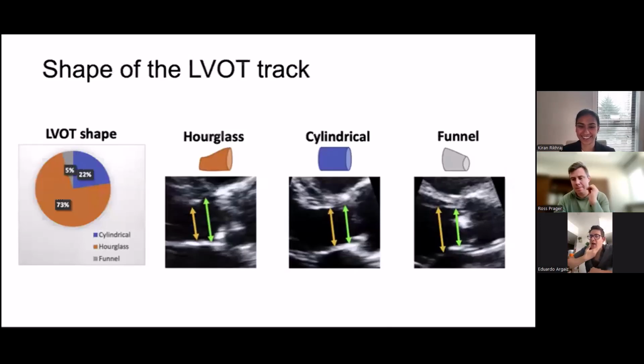Awesome. I would like to take just 3 more minutes before we wrap it up, because I just remembered a case where I think VTI was a significant contributor to a bad outcome of a patient. I had a patient with severe sepsis. She was an old lady who happened to have an anatomical variation that's usually seen in old females, which is a little bit thicker interventricular septum than the rest of the heart. And this was not a hypertrophic cardiomyopathy. This was just a sigmoid shaped septum.